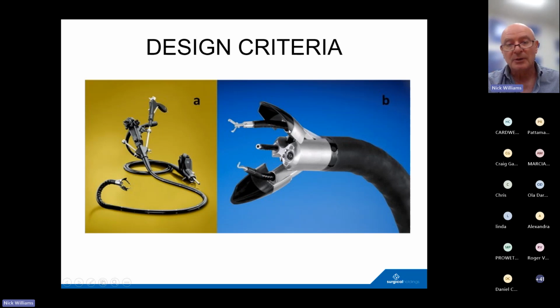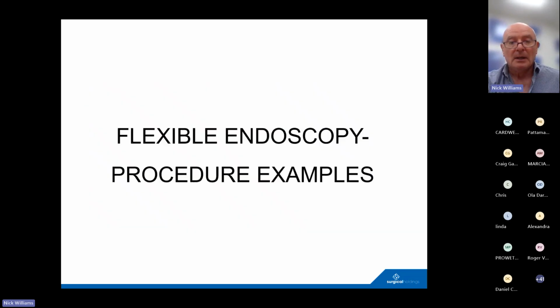It gives you two channels coming out, which gives a better surgical angulation to come in. This has a grasper and then a hook. It's got another channel where you could use, for example, a laser fiber, and this is the area that's devoted to the optics. That was developed but never really sold, but it was developed really for the natural orifice surgery I alluded to earlier. But certainly with something like that, I think that could be very interesting for how things are developed in the future. So that's giving you a bit of a side to the anatomy of the scope.